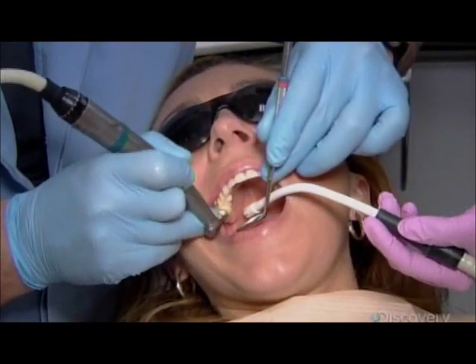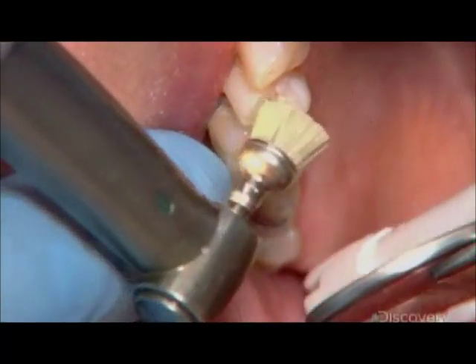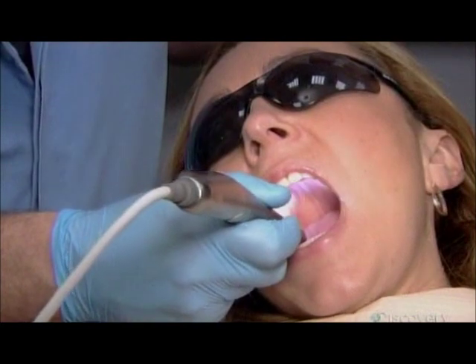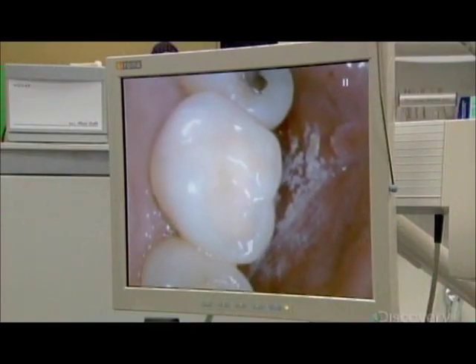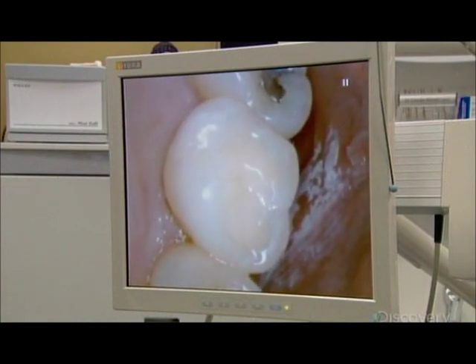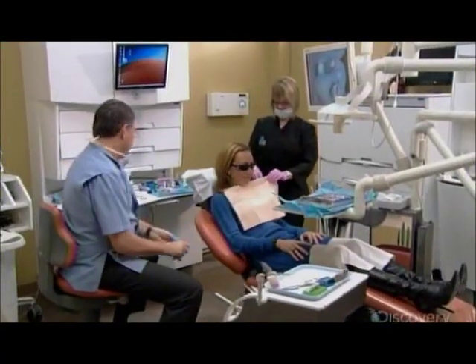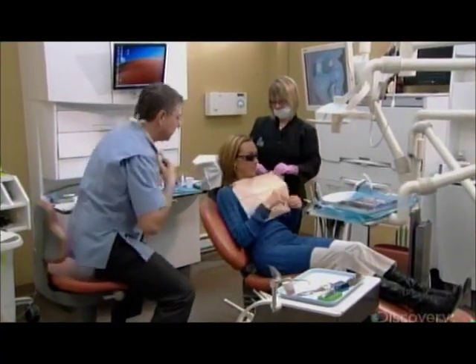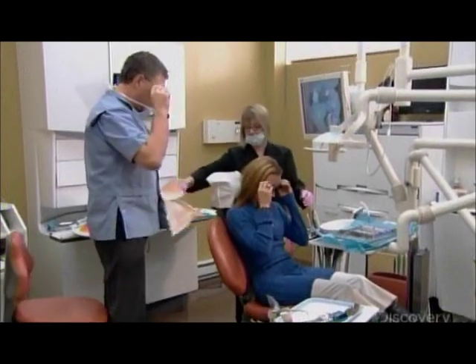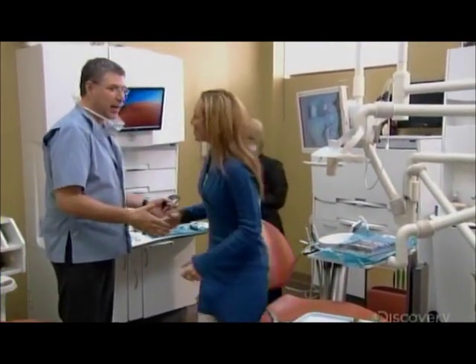He takes another impression of the patient's bite to confirm the new inlay is perfect. Finally, the dentist polishes the contours of the ceramic inlay. He uses the camera to magnify the new dental work for the patient's scrutiny. It's taken just an hour and a quarter for her custom restoration to be designed, milled, and installed — all thanks to digital dentistry.